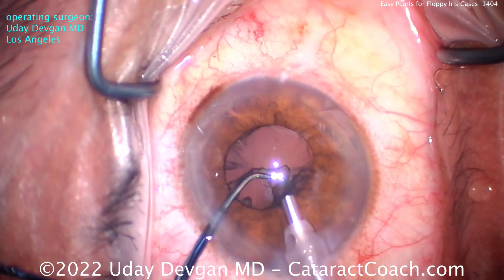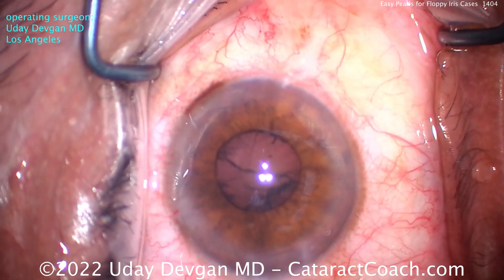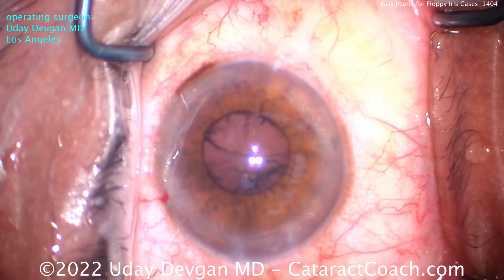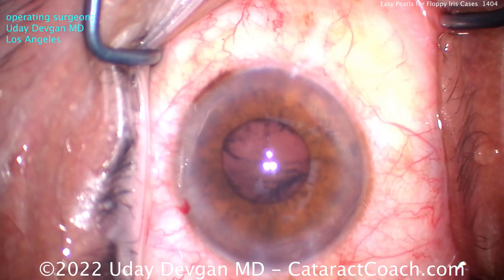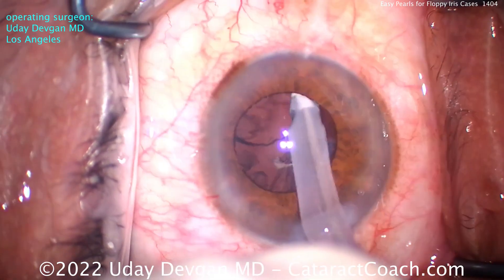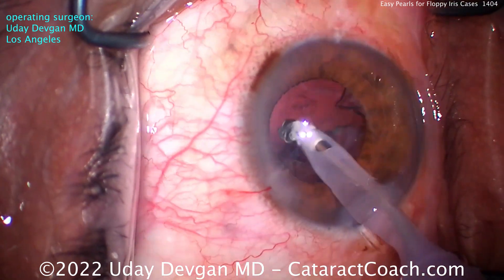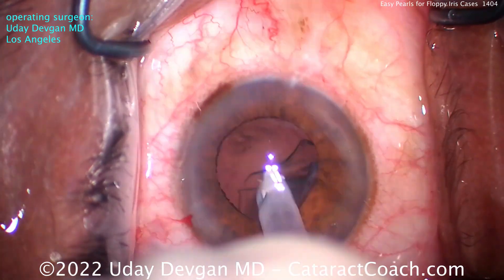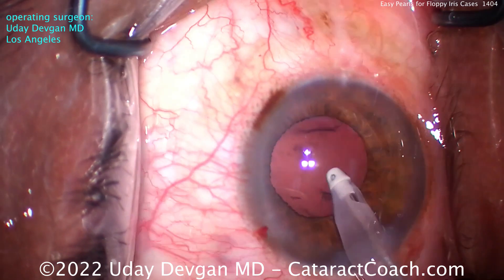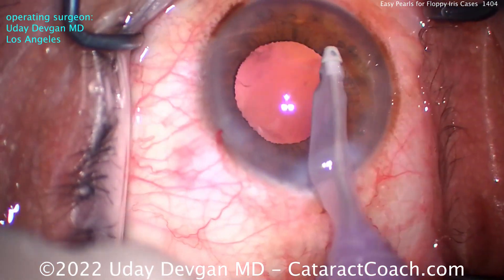Now look at the iris — the pupil is coming down even smaller. We put epinephrine, lidocaine, and phenylephrine at the beginning of the case, and still it comes down. You can also add things like phenylephrine or epinephrine to your infusion bottle — that may help too. But the pupil coming down is to be expected; that's okay. I keep track mentally of where the cortex is and what I've removed. Instead of jumping around, I do it in a systematic manner so I know I've gotten all quadrants of cortex out of the eye. We've cleaned it up pretty nicely.